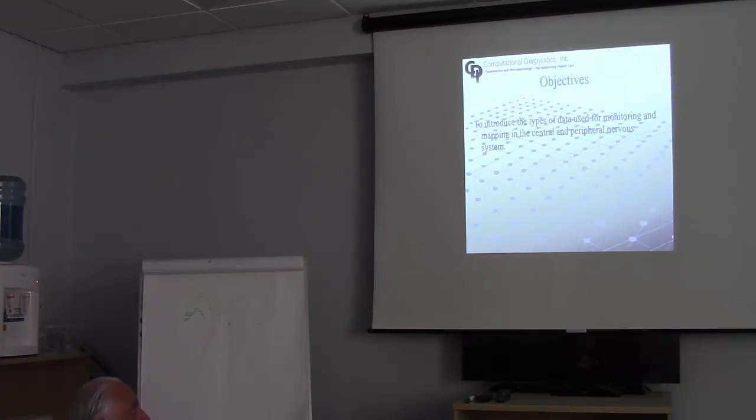I want to make a distinction between mapping and monitoring, because we'll talk in the tumor section about a lot of mapping, which is very precise, focal, trying to delineate where pathology may be with respect to an area of the brain you want to preserve, and then monitoring, where you're continuously recording, trying to feed that information back. So there's a distinction there that I'm going to try and make, and how these different classes of data fit into that.